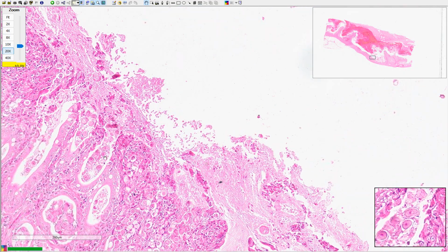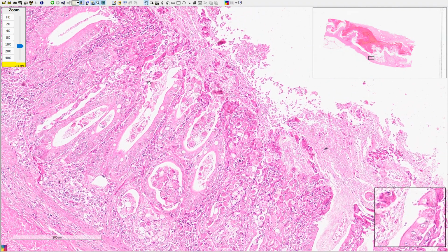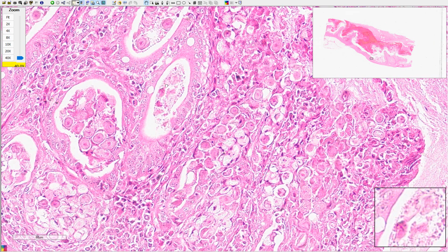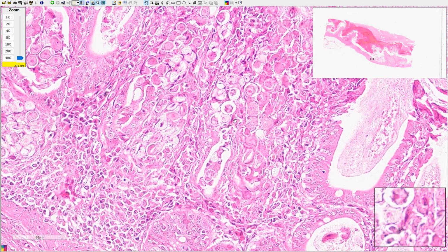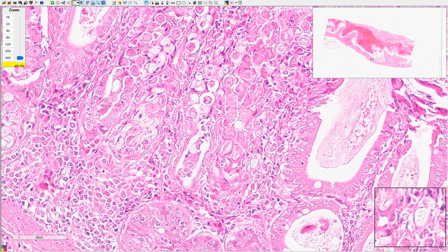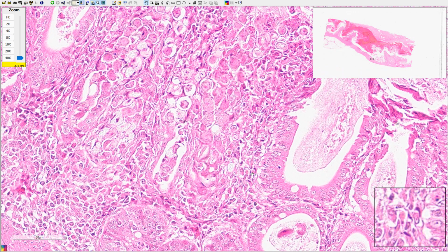And then, if I enlarge this, in the crypt itself, you will find the oocyst, and also inside the epithelia of the crypts, you can find lots of stadia of coccidial growth. For example, macrogametocytes, microgametocytes, you can find here.